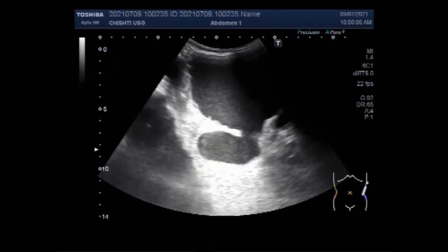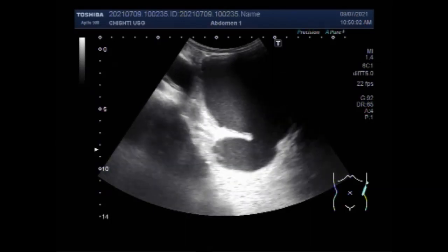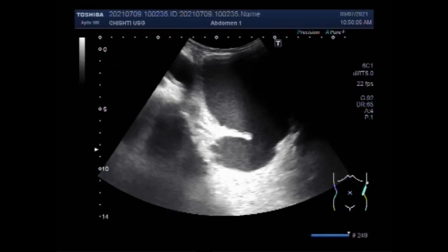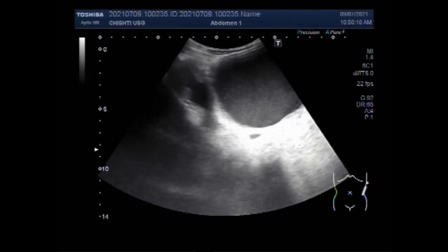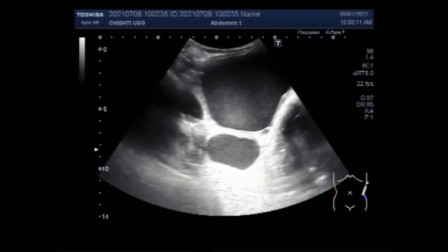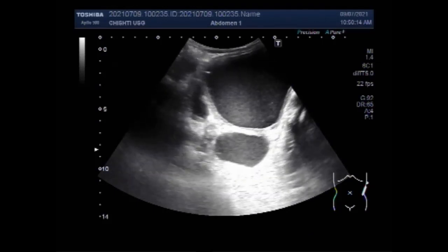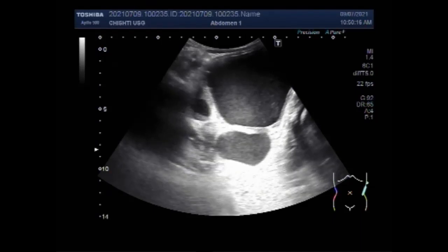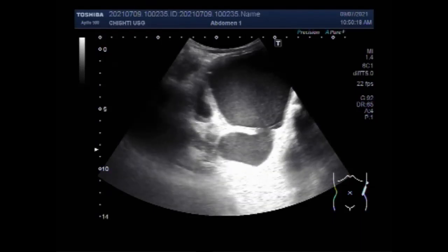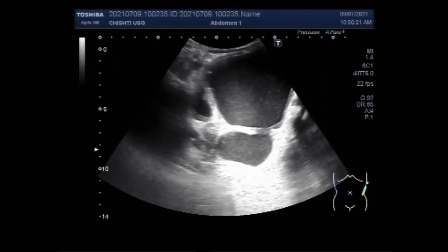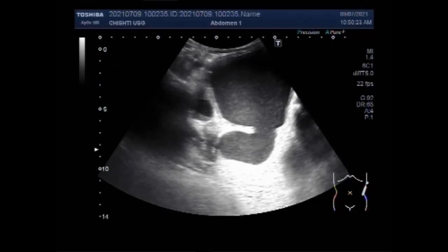The cause of this hydroureter is severe urinary tract infections. As you can see, pus is seen — thick fluid is seen in the urinary bladder. The diverticulum is also seen, and you can see the communication between the urinary bladder and the diverticulum.